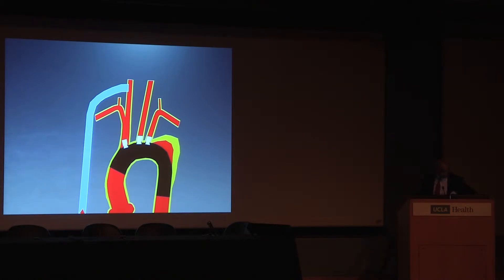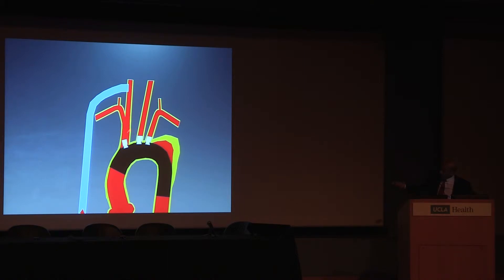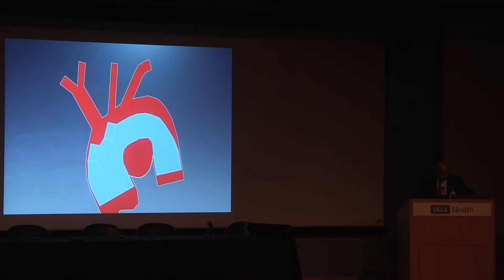Desperate times call for desperate measures in some patients. Here's an animation of a high-risk patient where you resort to off-label uses: the patient is having their carotid perfused from their femoral artery with a standard thoracic graft, then in-situ fenestrations are performed. Our cardiac surgeon in Portland did this recently with a symptomatic patient who had a previous type A dissection repair, and the patient did very well — especially when you protect the carotids with antegrade perfusion and clamping to prevent neurological events.